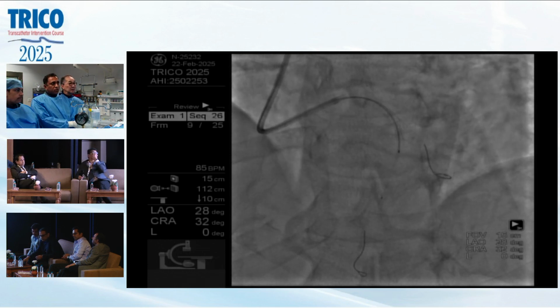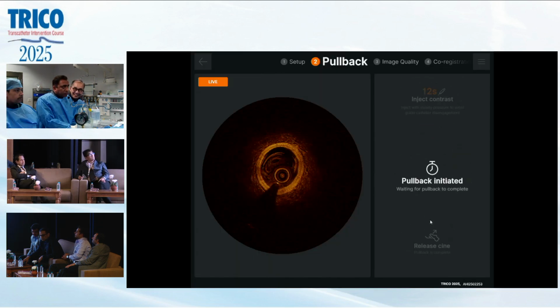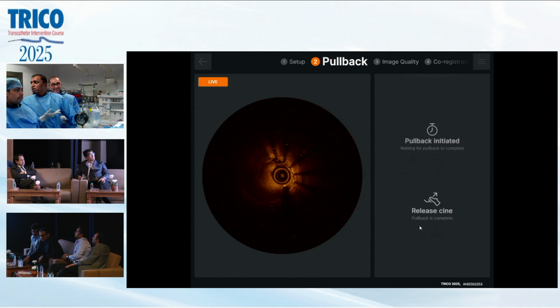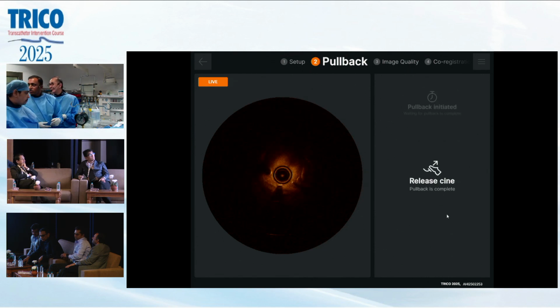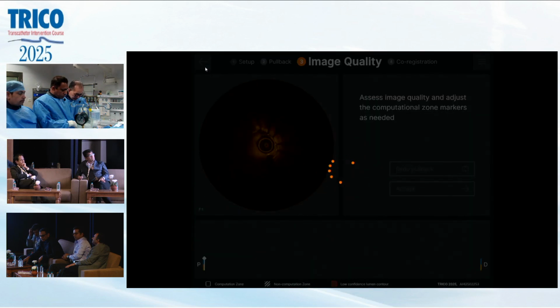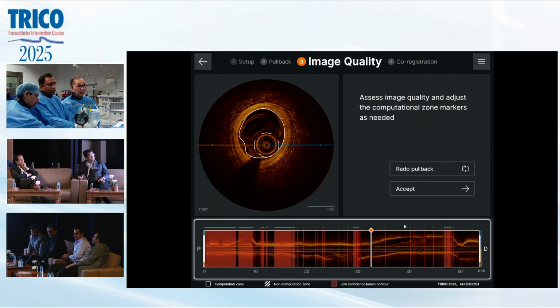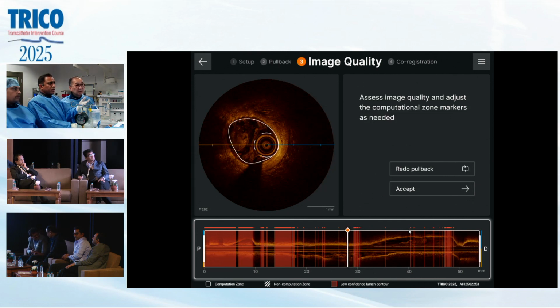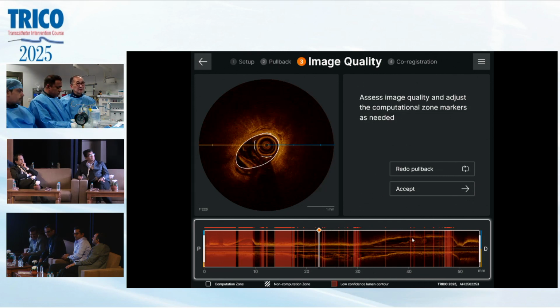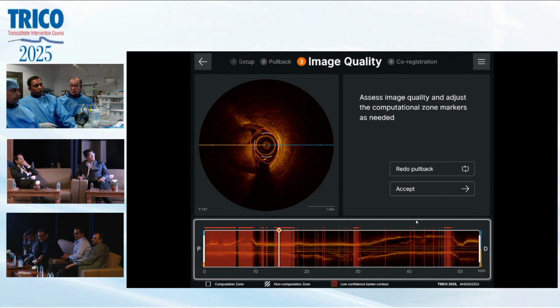Why didn't we see the OCT? I did not see the OCT inject. We couldn't see. No, because we're late. We need to see the screen. Okay, so let's move back here. Can we do one? Can we do it?